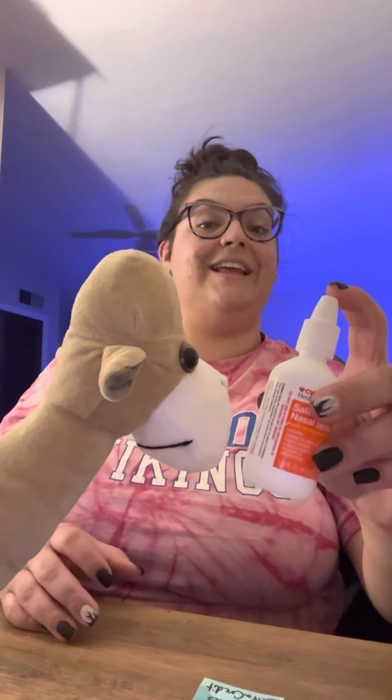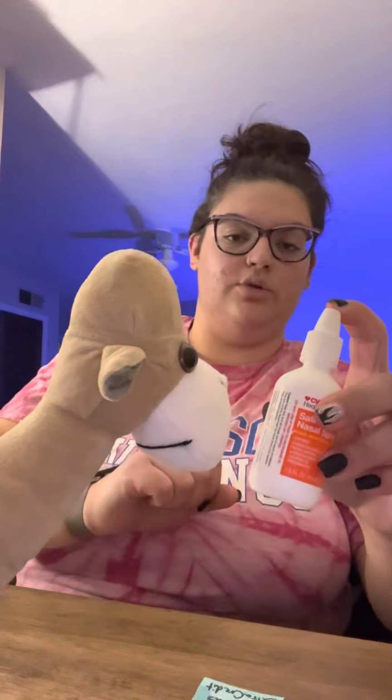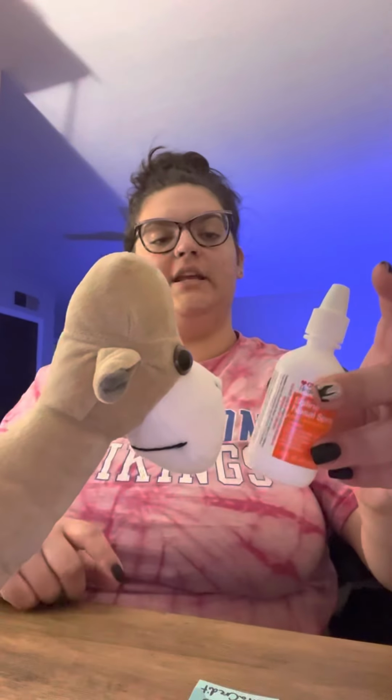So I will shake it here, take off the mouth guard. I will hold it up here to his mouth for him. And then at the count of 3, because he is unable to hold it himself, I'm going to press down and he will inhale simultaneously.